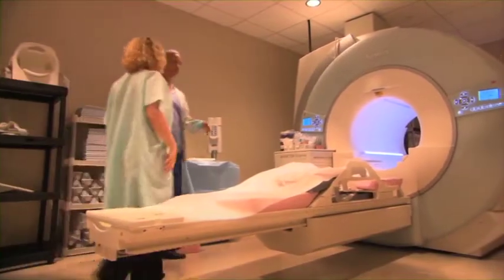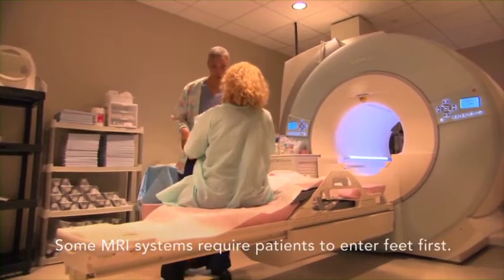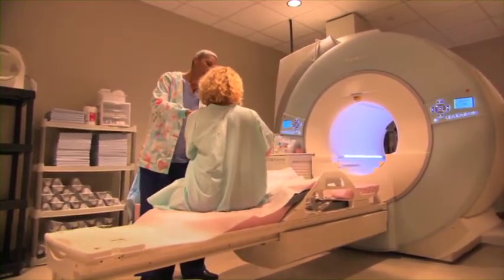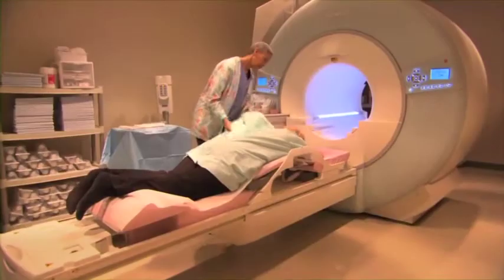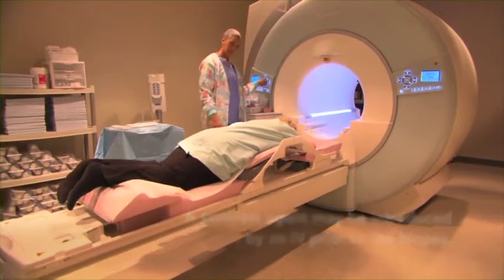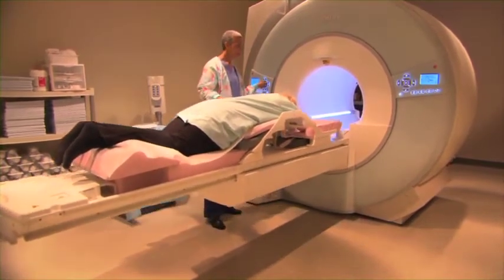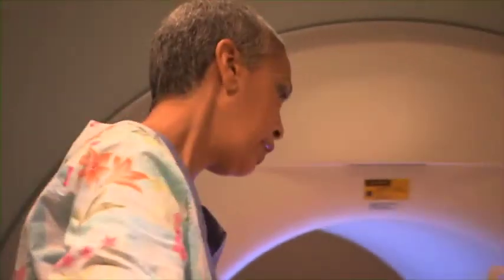Your biopsy will take place in an MRI suite. You'll be lying down on a special table while the team takes images and performs your biopsy. Normally, you'll move in and out of the magnet about 3 or 4 times during the procedure. The technologist will be in close contact with you the whole time. Once you're in position on the table, your technologist will very carefully position and compress your breast using the MRI compression coil.